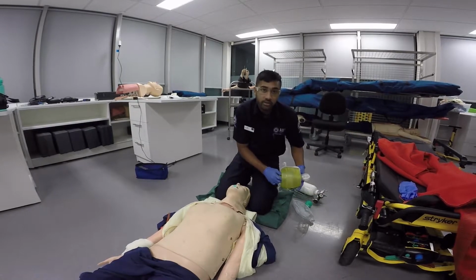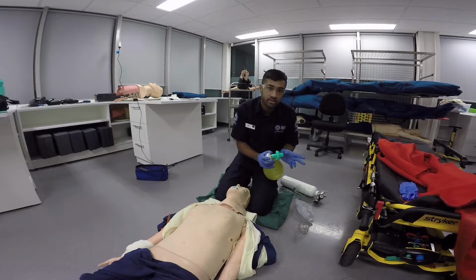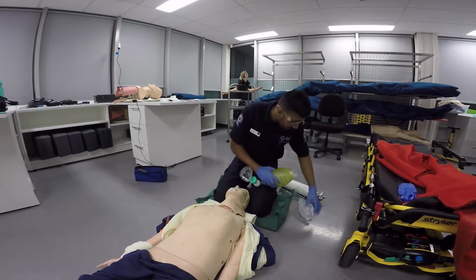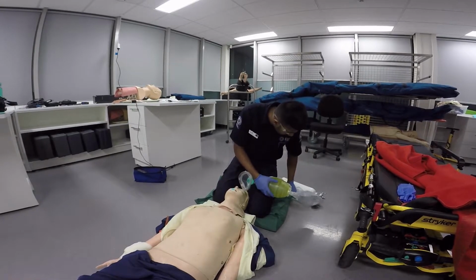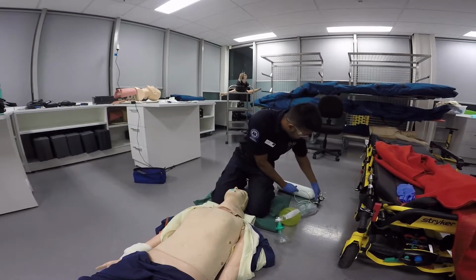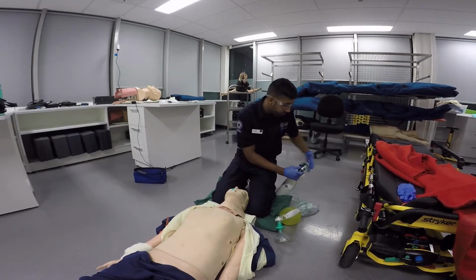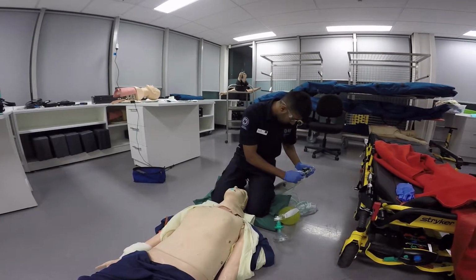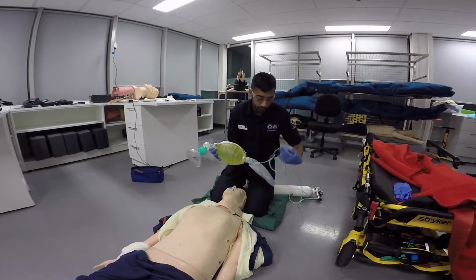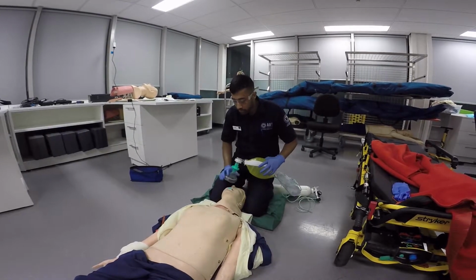Then I'll begin constructing the bag valve mask, placing the filter in on this side like so, with the patient's side facing outwards, which is then connected to the mask. On the opposite end we have the reservoir bag, which is connected to the oxygen tubing like so, which is then connected to our oxygen tank. For the bag valve mask, we use a flow rate of 15 liters a minute, and you should be able to see the reservoir bag inflating, but we don't have any oxygen, so you won't be able to see that.